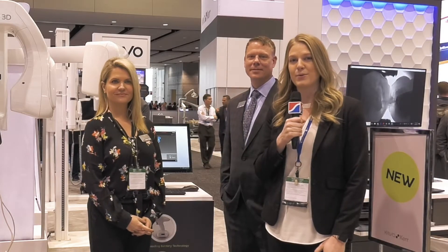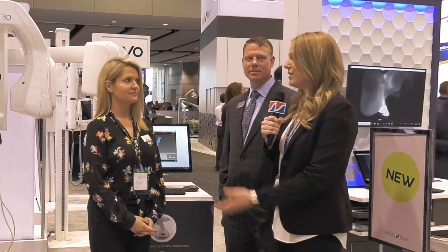Hello everyone, we're here today talking about the brand new CAVO OP 3D with Ceph unit. I'm here with Anna Johnson and Sam Gaunt from CAVO Kerr at the Chicago Midwinter. So Anna, can you tell us a little bit more about this new 3D unit?